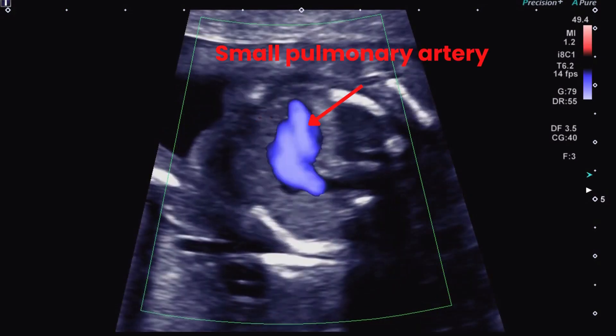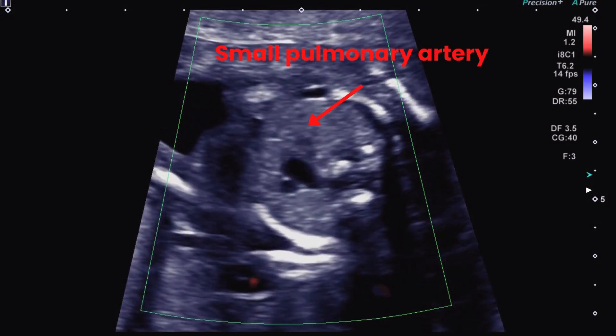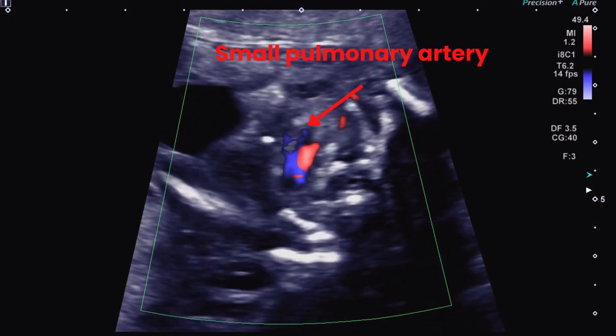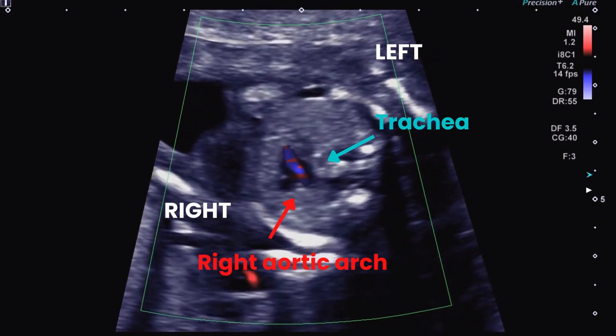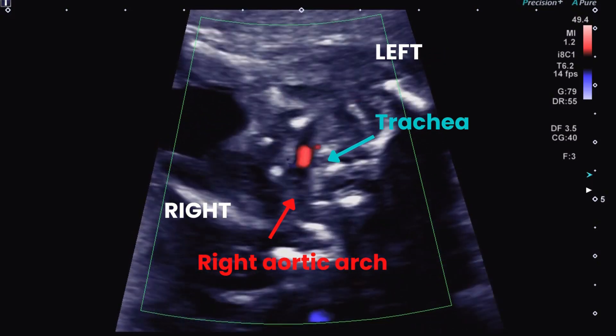You can see the pulmonary trunk is a lot smaller than the aorta, and also the right-sided aortic arch coursing to the right of the trachea.